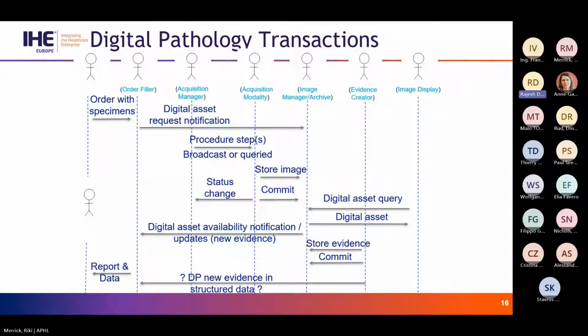We have a role here for something that creates new evidence, different than the scanner that works on a whole slide image, and I'll talk about that in a little bit more detail. And of course, we need to be able to see these images, so we have an image display actor. And I think next slide.